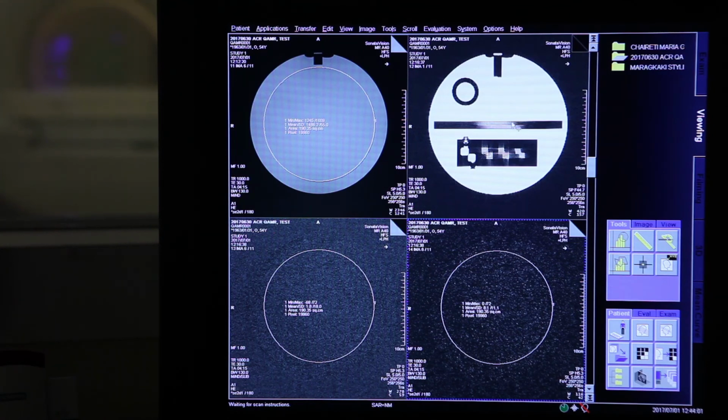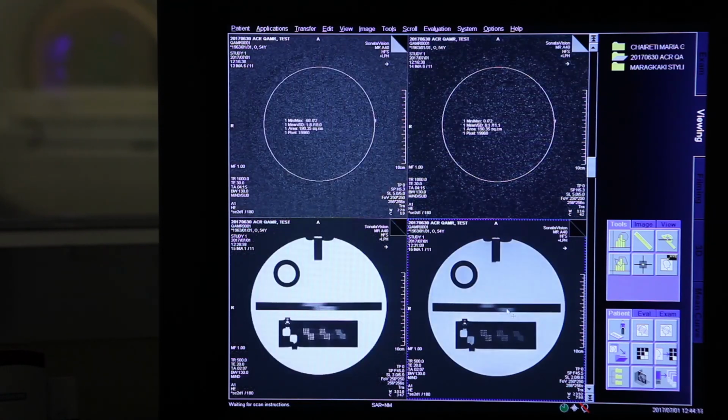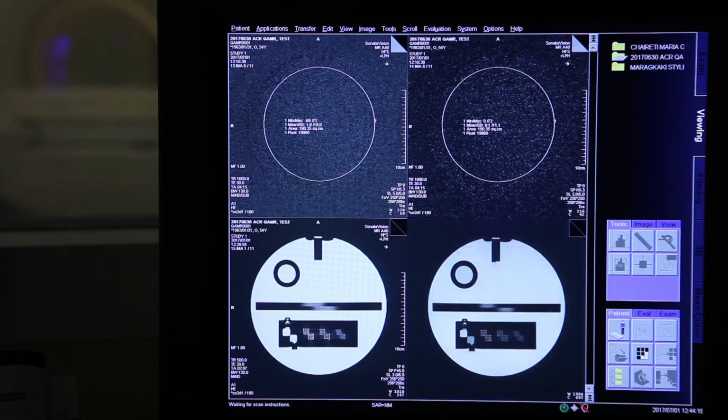You don't have to apply a mathematical formula that takes into account all this tangential stuff. Anyway, this is the 5mm slice and you have this size. Now we go to the 3mm slice. The size is changing. It's narrower, as we expected, because the slice is changing. It's getting less. The 2mm slice looks a little bit better. Even smaller.